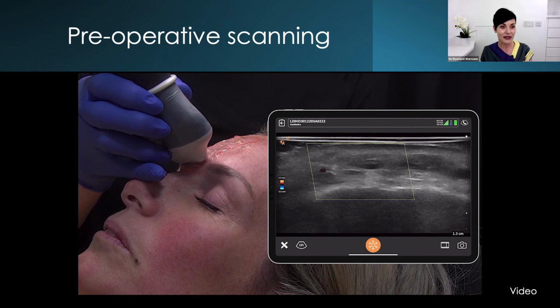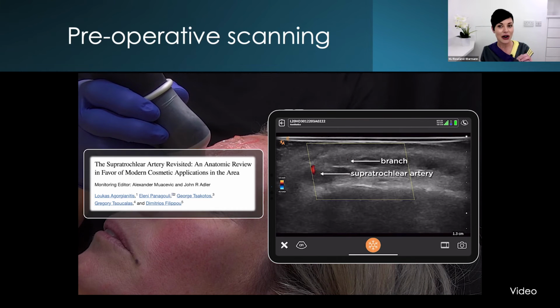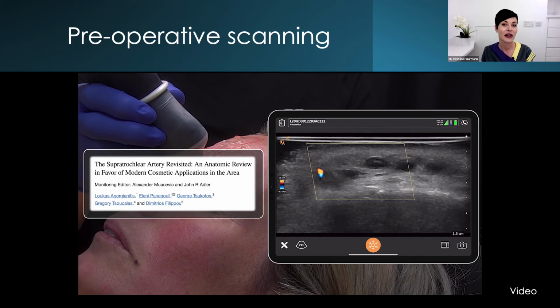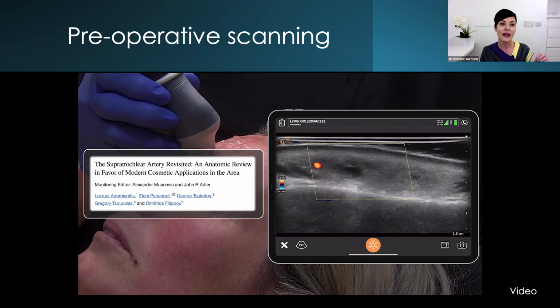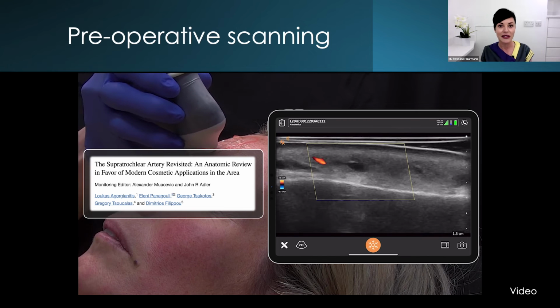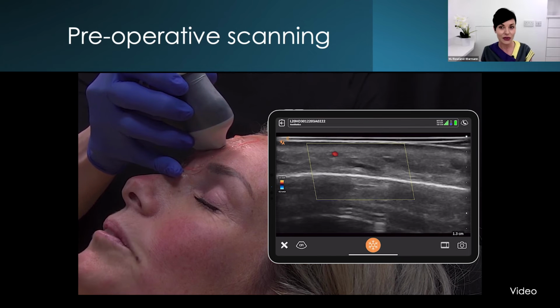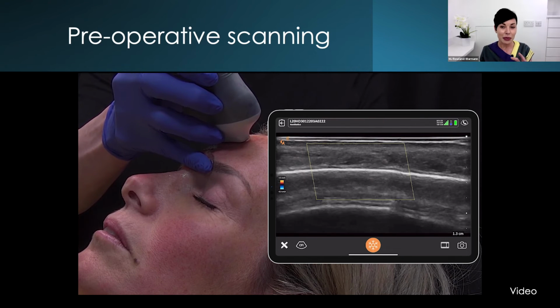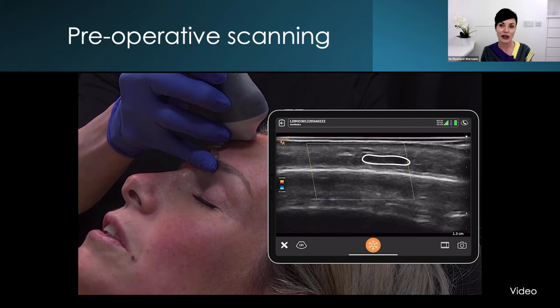So here's where it gets interesting. We're in the glabella at the supratrochlear. Agorgianitis described the supratrochlear as passing superficial to the corrugator, deep to the orbicularis and frontalis muscles with an extremely variable course with many branches. Advancing cranially, we see the supratrochlear come a little closer to the skin. And again, we've got a large filler deposit very close to a vessel. This is the area she described as painful. There's a big old filler deposit right next to a branch of the supratrochlear artery.